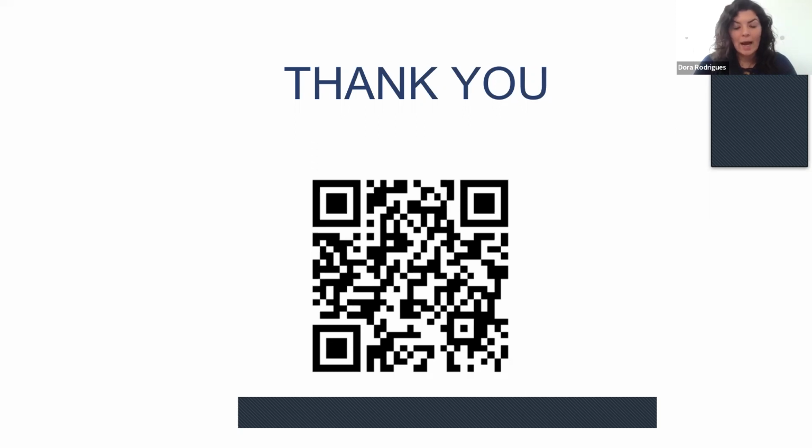So I would say start, because I feel that printing is here to stay, and sooner or later, more products are coming out too. So if it makes sense for your business, try it. Once printers came to my lab, it's been tremendous. Like, I need this denture again, okay, I can just print it.